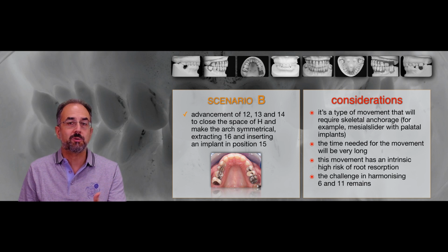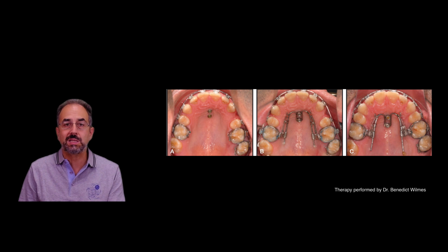To move mesially posterior teeth, nowadays we can use this type of skeletal anchorage. We have started to use this in the last couple of years, and it's extremely effective. So it is possible, but it takes time.